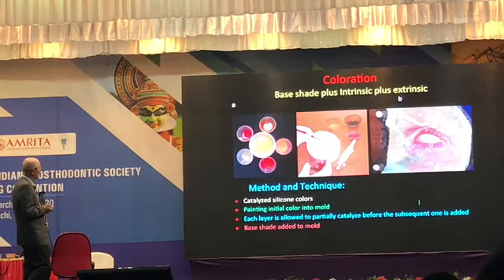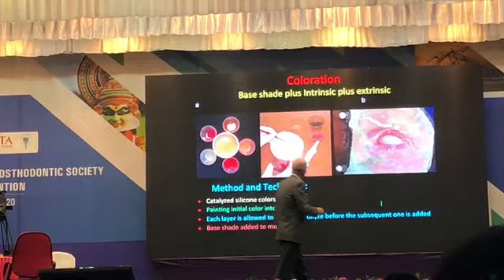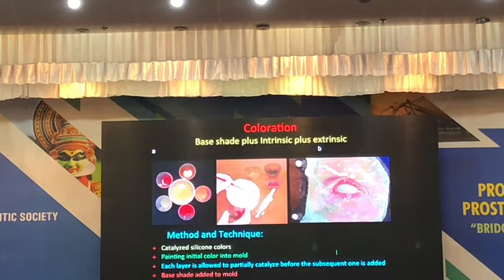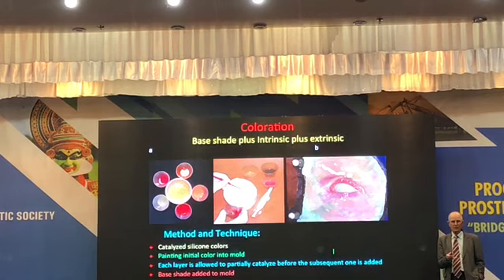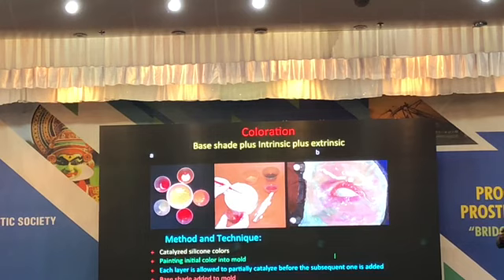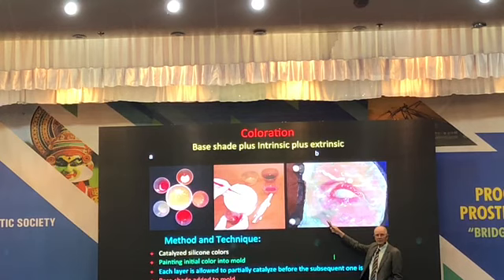And then this is an example of intrinsic coloration, so you can see the area around the lids were colored a little darker color to match the opposite side. But that's very tedious. You have to apply the silicone and the colorants and let it set a little bit. It has to polymerize a little bit before you can add additional layers on it. That's why it takes so long. When you're applying extrinsic coloration, just apply, you do that in 10, 15 minutes, you're done. But when you're doing intrinsic, you have to let some of this polymerize a little bit, otherwise the stuff starts to move around and it doesn't stay where you want it.